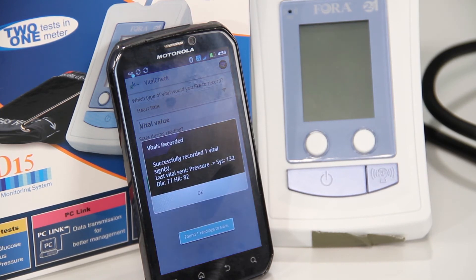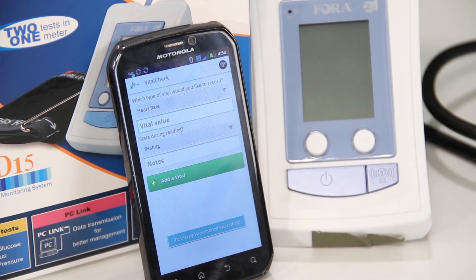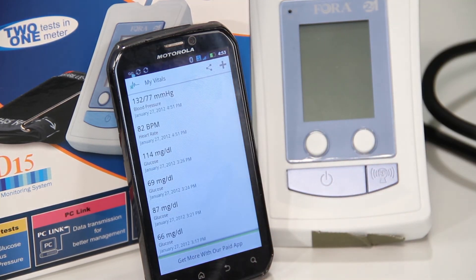A confirmation message will appear stating you have successfully recorded the vital sign. Tap OK. Go to MyVirtualHealthCheck.com to take advantage of more health and wellness tools to monitor and maintain a healthy lifestyle.